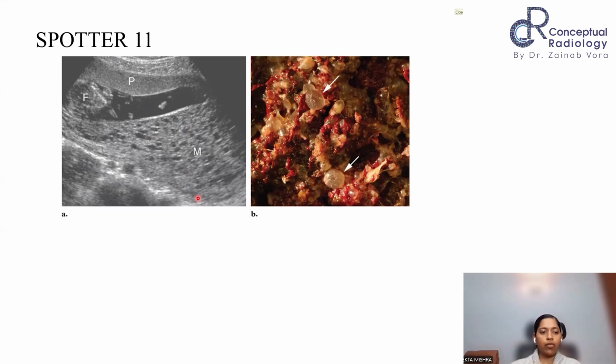It can be partial mole because I see first the cystic grape-like vesicles, everything partial mole. And I see the baby also, some part of the baby. So partial mole. But what if I tell you this baby is hale and hearty, absolutely fine, good cardiac activity, moving, NT present, everything is good. Then now does your diagnosis change? Beta HCG is still very high.